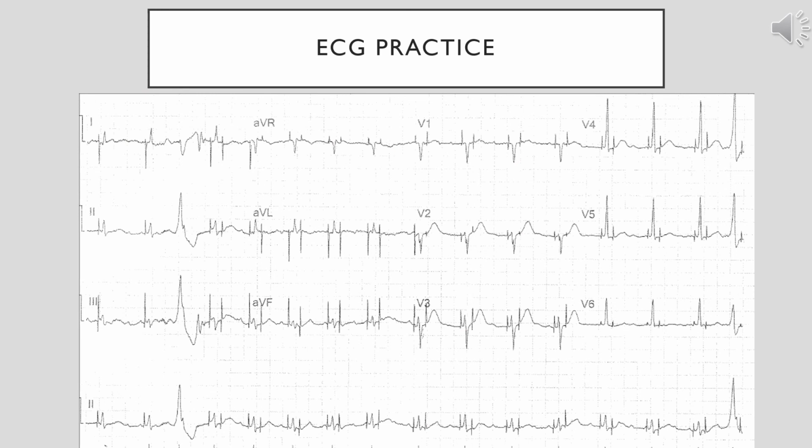Okay, looking at this EKG, we see a whole bunch of up and down patterns. So before you start thinking that this patient has a whole bunch of QRS complexes, you should realize that these are pacer markers. Okay, so a pacer spike is going to be shown through the EKG with a line that goes up and down. So you can see where a pacer is as far as that electrical conduction is initiated, and it should be followed by a QRS complex.